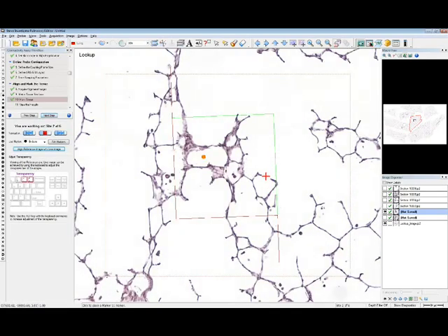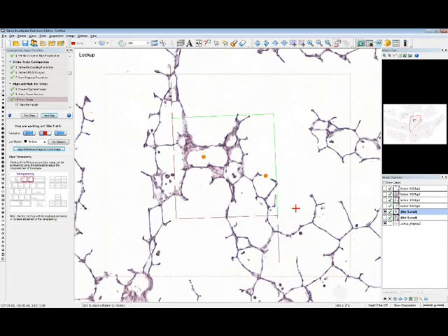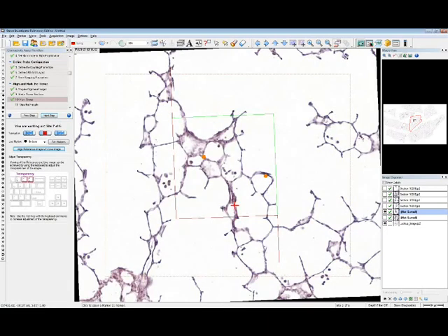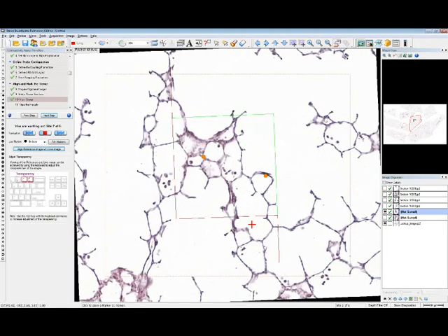Then also over here on the right-hand side, you will see there is no bridge here, but there is a bridge on the reference. So we'll go ahead and count that one. And also on the bottom, you will see that on lookup, there is no connection over here at the very bottom of the screen. But there is a connection here, but you will see that that bridge actually is going over the red line, which is why I'm not going to mark it, because we can't count anything that is touching or crossing the forbidden line, which is the red line on the screen.